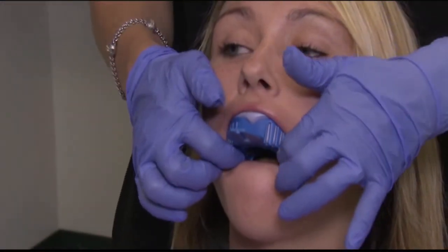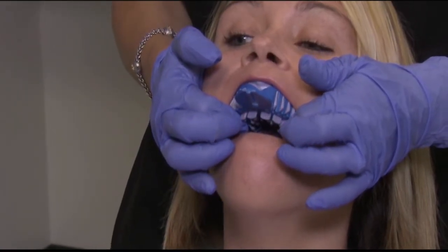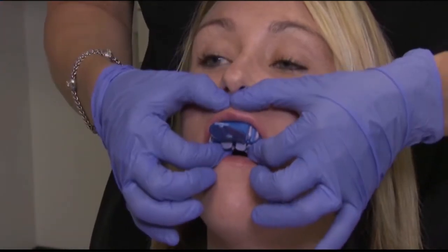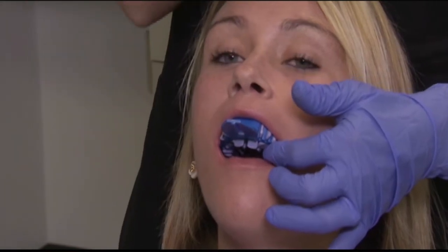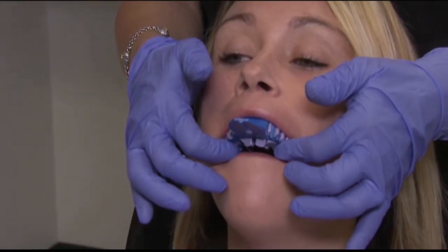This material is very thick, so I have to use a lot of force to push it in and make sure I'm getting all the teeth into that material. And notice where my hands are. I'm massaging her face. I'm holding it in the premolar area. I've got really good control of that tray.